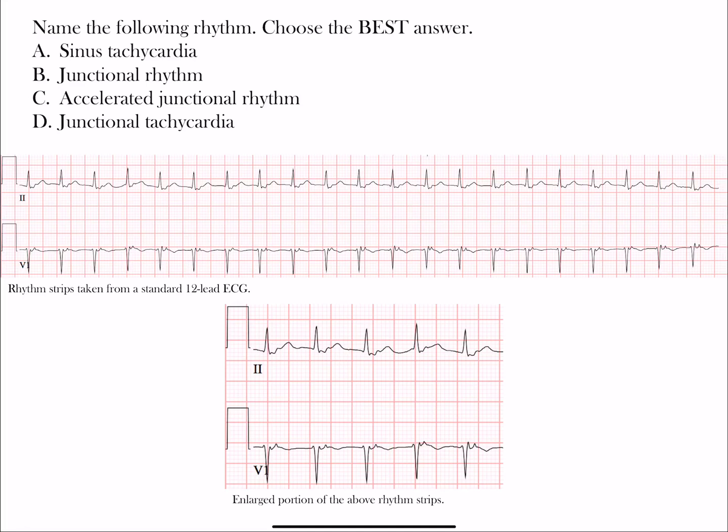Welcome back to the next rhythm challenge. Today we have four choices. We have our rhythm strips with lead 2 and V1 present from a standard 12-lead. Lead 2 is an inferior limb lead at positive 60 degrees, and V1 is our right precordial lead.